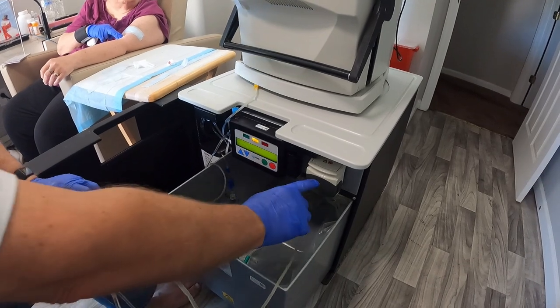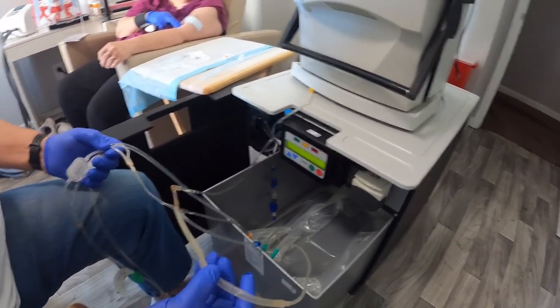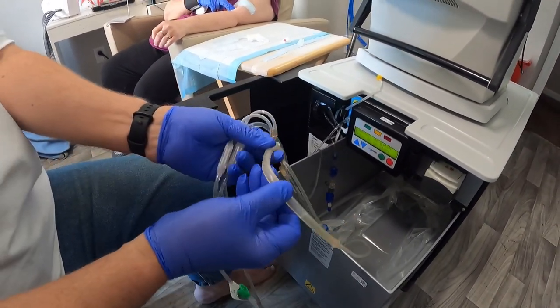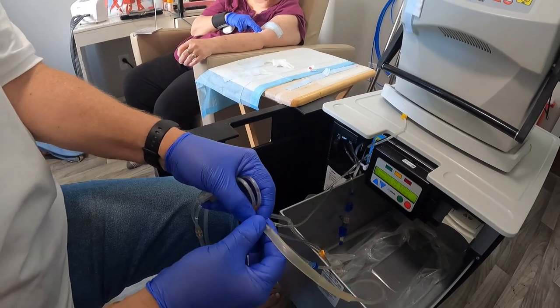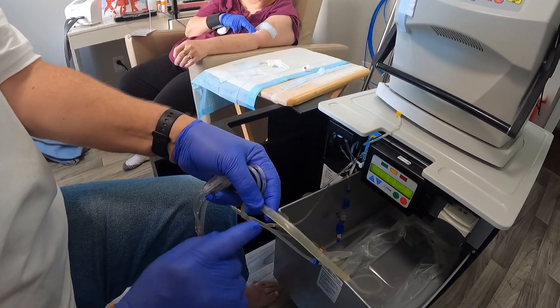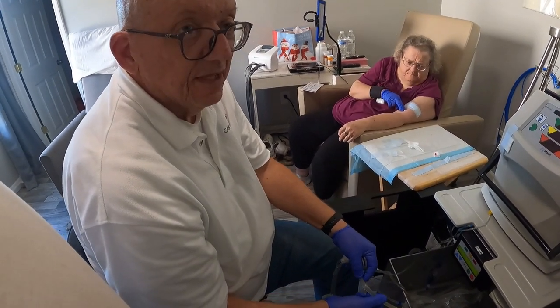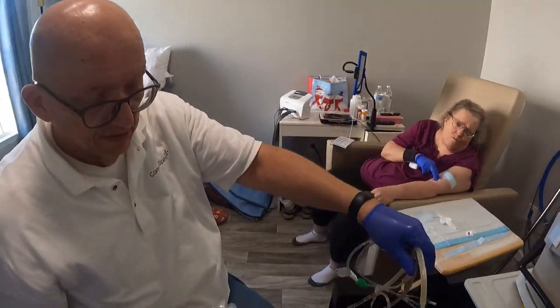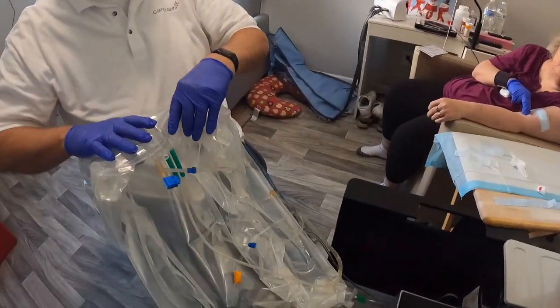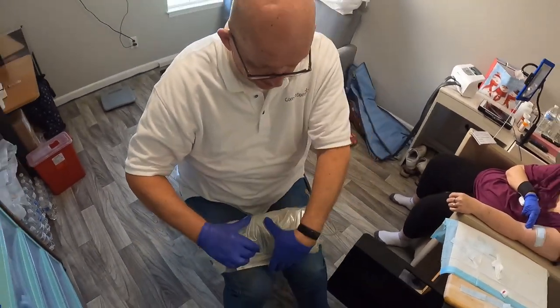So you can see this is the pump. And this hose, see how it's thicker? You see how it's kind of got a dent on it? That pump, to pump things so it's non-contact, it just squeezes this hose. And that's what causes it to pump. That's why it's a durable hose. Just get some mileage. And then I fold these different ways every time.